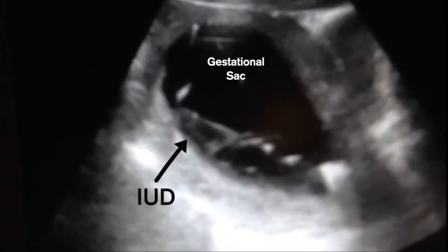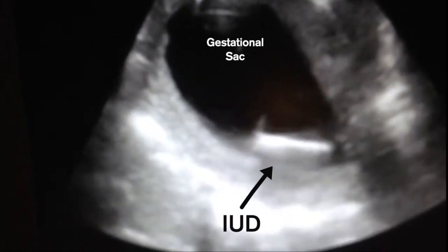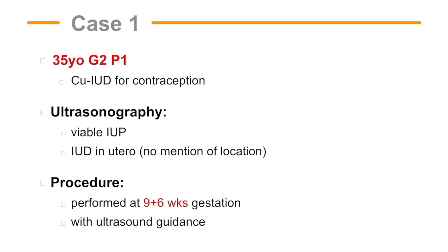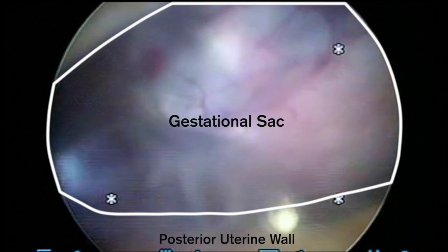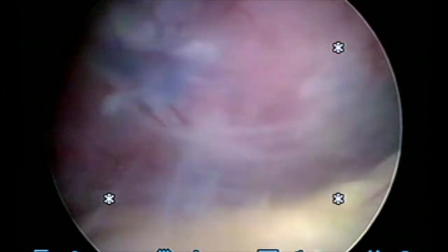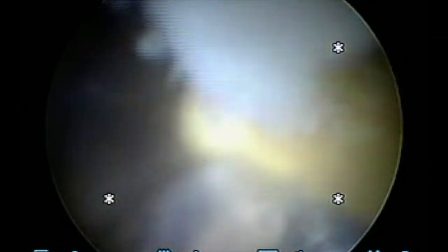Ultrasound guidance can help identify the IUD and facilitate its removal in an uncomplicated fashion. Case 1 is a 35-year-old Gravida 2 Para 1 who had a copper IUD removed at 9 weeks and 6 days under ultrasound guidance. Hysteroscopy is performed without cervical dilation. Upon entering the endometrial cavity, the gestational sac becomes visible. Visualization is challenged by extensive mucus and debris that mixes with the limited infusion of saline distension media. A hysteroscopic grasper can be advanced through the operating channel of the hysteroscope and used as a probe to help identify the IUD.